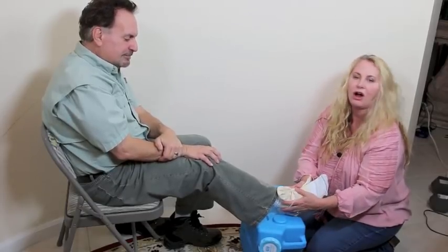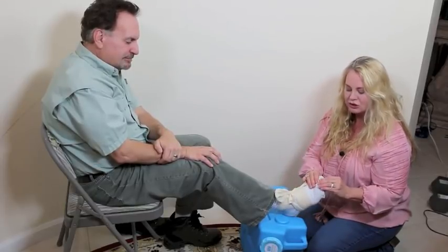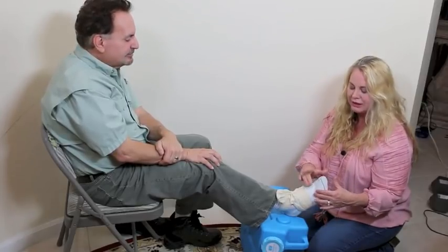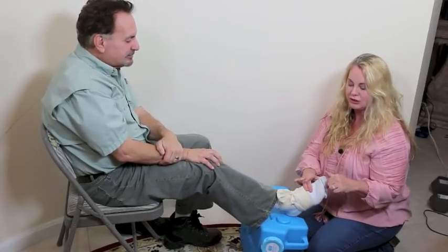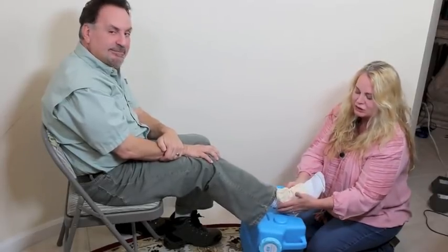Make sure you have a sock underneath or at least some padding — you don't want this directly on skin. Check the circulation: cut off the tip of the sock, check capillary refill, make sure the tissue is pink, and check for a pulse to confirm it's not too tight. This is a nice way to stabilize an ankle.